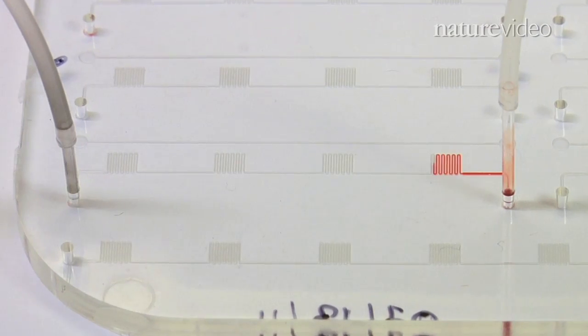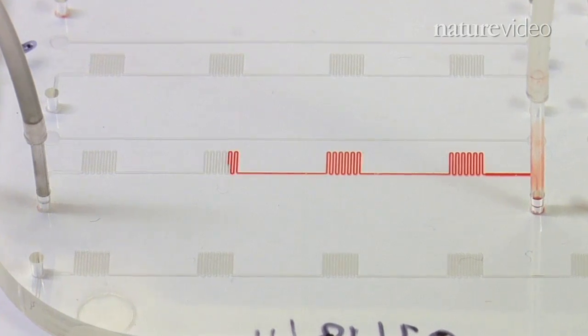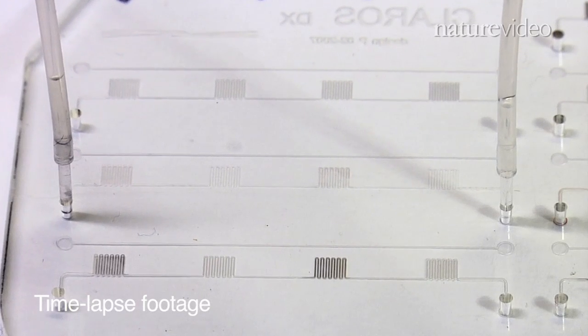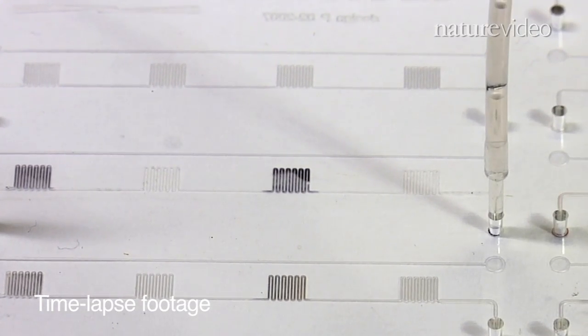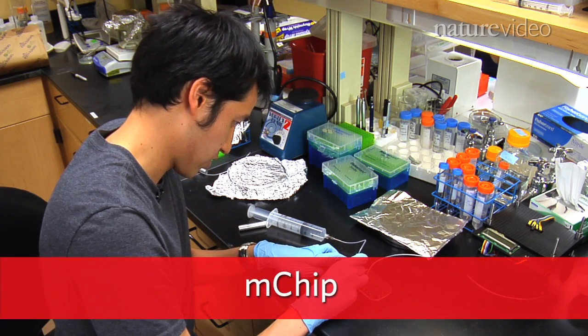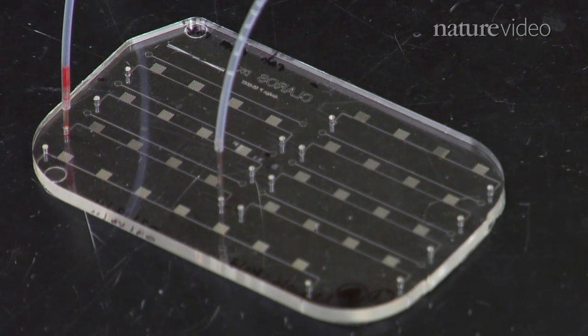A plastic chip about the size of a credit card could one day diagnose disease in the remotest regions of the developing world. Using just one microliter of whole blood, we were able to get detection of HIV in the field with less volume in about 15 minutes instead of several hours. The device, dubbed the M-CHIP by Samuel Sia and his team at Columbia University, is designed to work in places without access to advanced lab facilities.